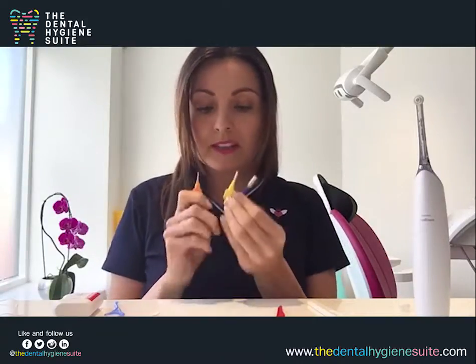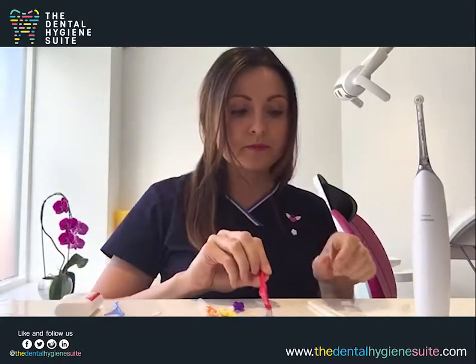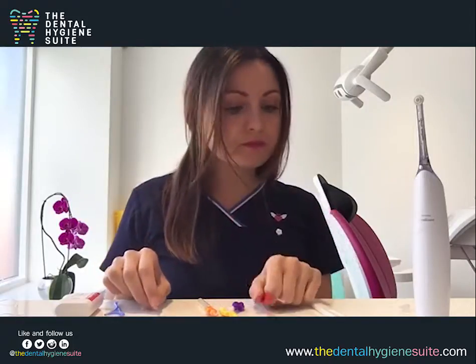Now, the next thing, we've got these little wire interdental brushes. They are plastic coated. They come in lots of different sizes, so when you see your hygienist, just ask which size is the best for you. These are probably the most effective at removing the plaque. So they also come in a long handled one as well. They're quite new, so you might not have seen those before. But they're used exactly the same way as the little rubber brushes.